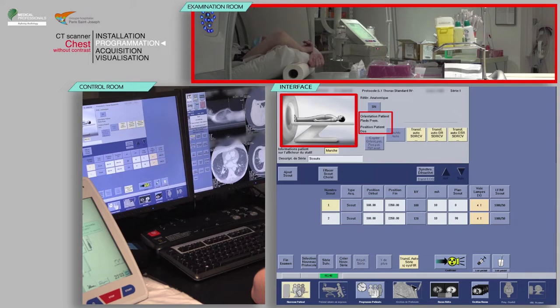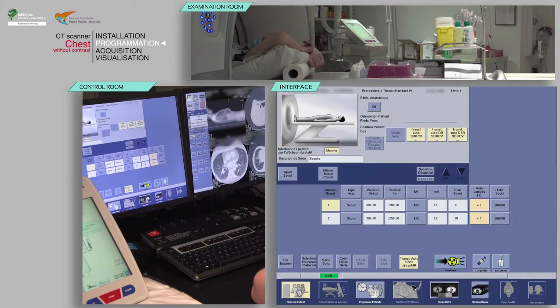Here the patient's orientation is feet first. After verifying the scan parameters, click confirm.